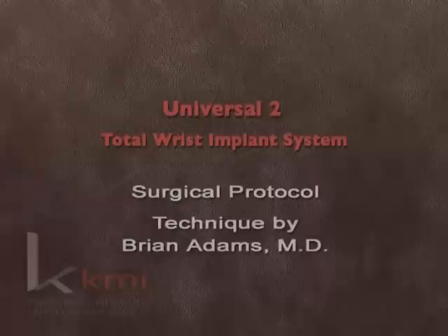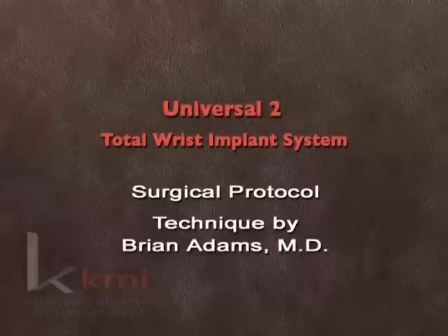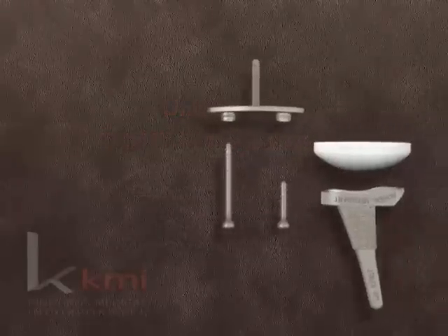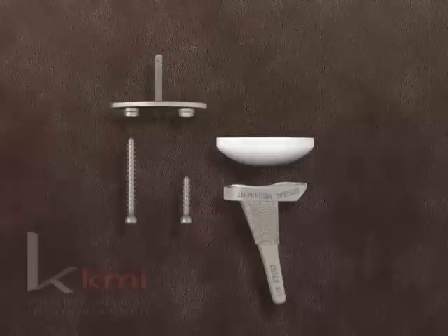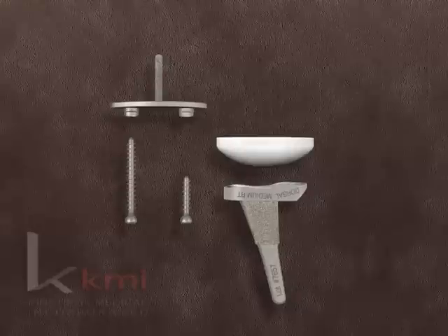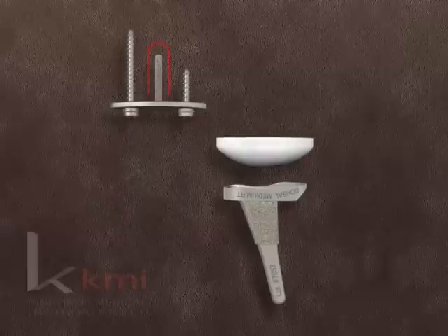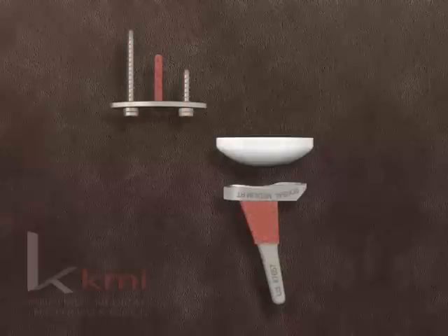Introducing the Universal II Total Wrist Implant System from KMI, a revolutionary step forward in the treatment of wrist arthritis. The Universal II has been specifically engineered for substantial improvements over earlier generation wrist implants, including a unique articular geometry that provides good motion and immediate stability for early range of motion and return to activities. The carpal component is fixed by a central stem and two screws, augmented by an intercarpal fusion for solid support of the implant.